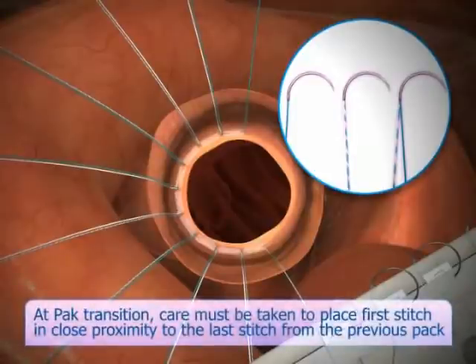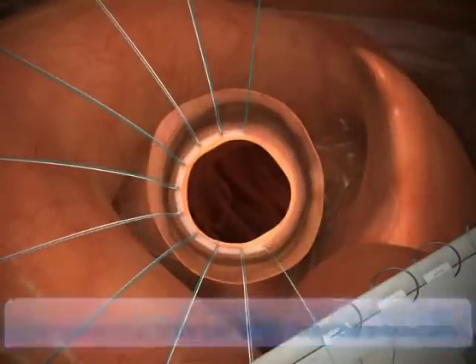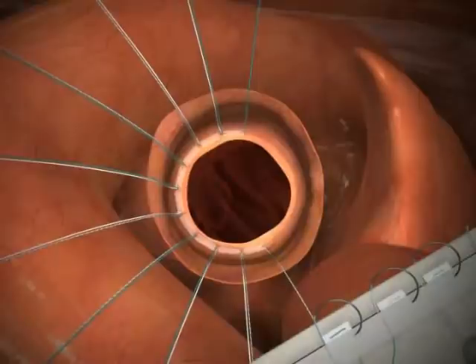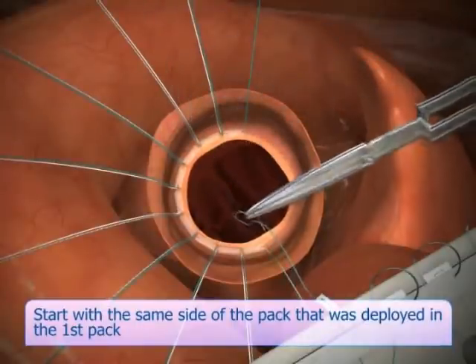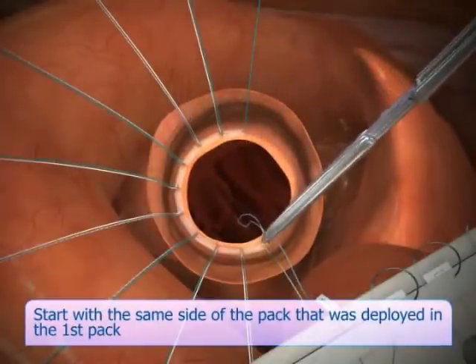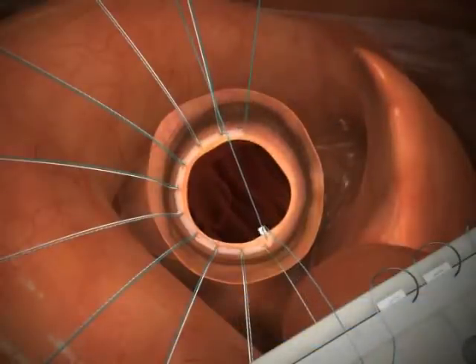At pack transition, care must be taken to place the first stitch in close proximity to the last stitch from the previous pack. If you are using more than one pack and working around the valve circumferentially, start with the same side of the pack that was deployed in the first pack. Place the needle in close proximity to the last stitch placed, then complete the steps previously mentioned.